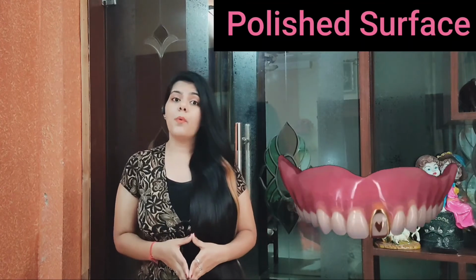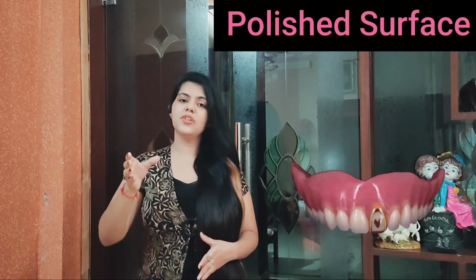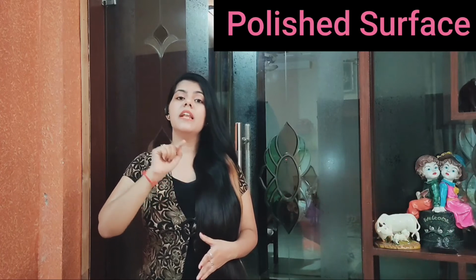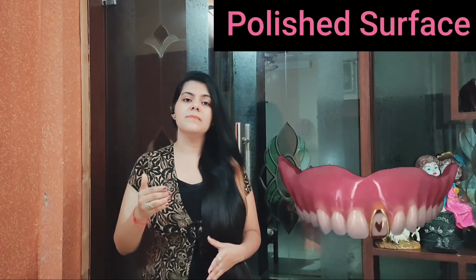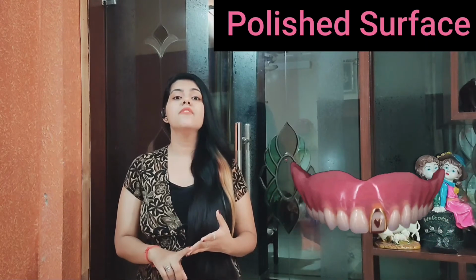Now, what is polished surface? It is defined as that part of the denture which is extended from the border of the denture up to the labial and the occlusal, or we can say it extends up to the external palatal surface. This surface includes the labial, lingual and buccal flange.